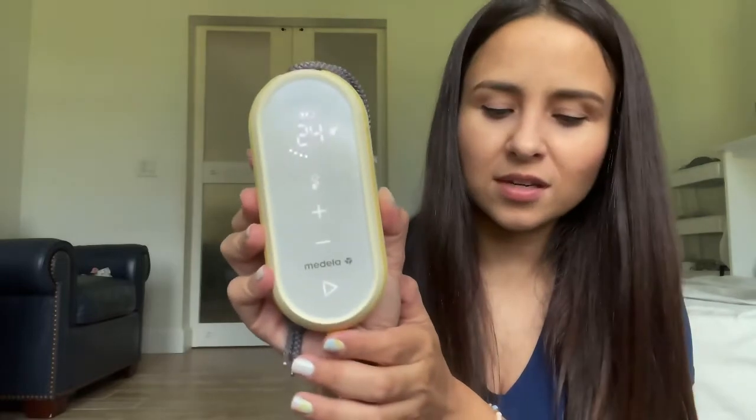Let me show you the functions of the pump quickly. It doesn't have as many options as the Lansinoh pump I used the first time, but it's so easy to use that you don't need that many functions. You turn it on and press play. This button is for let-down mode — pretty much when a baby first latches, they suck very fast to stimulate you and get the milk flowing, then they slow down. The pump does the same: after about two minutes it automatically goes slower. And then you can go up or down on pressure — more if you want, less if it's too painful. That's it — those are all the options.